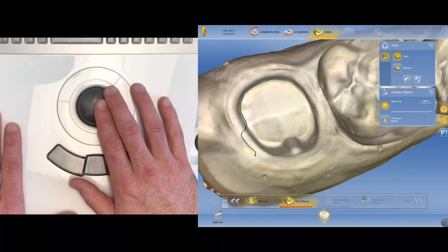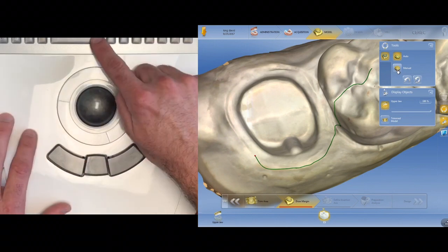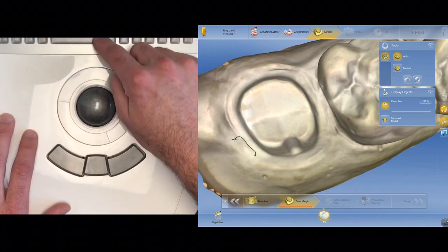Two ways to do that. I can see the margin is still active, I'm just leaving it there. I can either go over here and click manual, or I can use the space bar to turn it on manual. I like to use the space bar because I'm lazy. Dragging the mouse over there is too hard for me, I guess. So I'm just going to click the space bar.